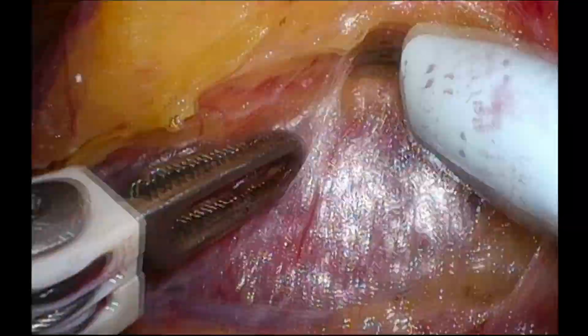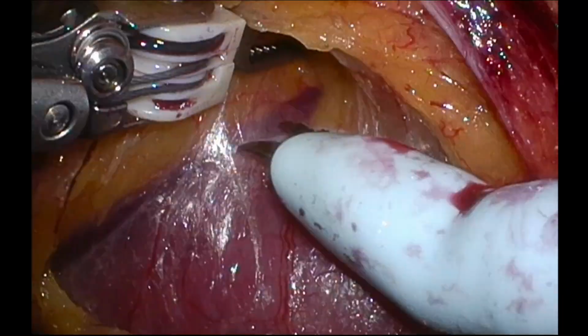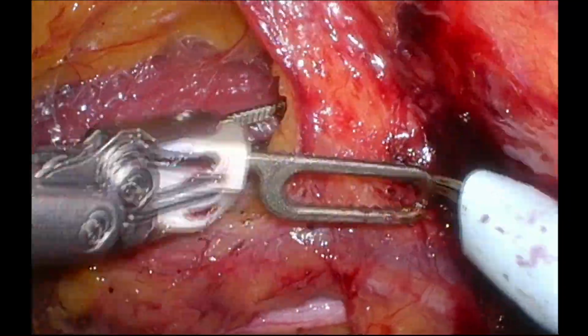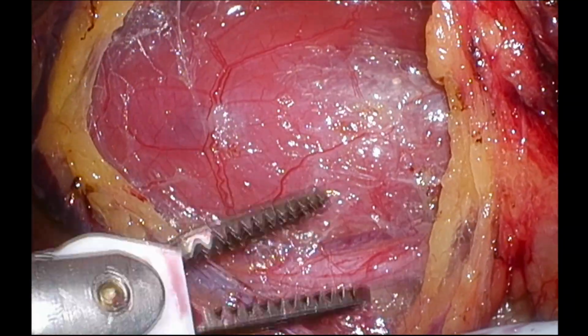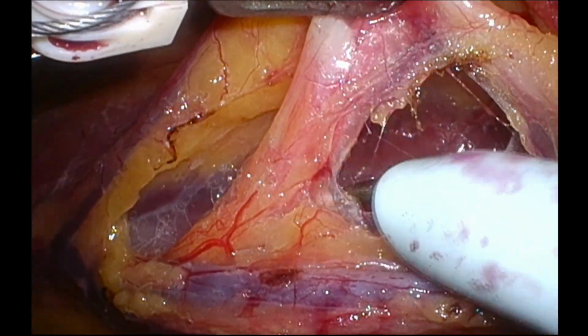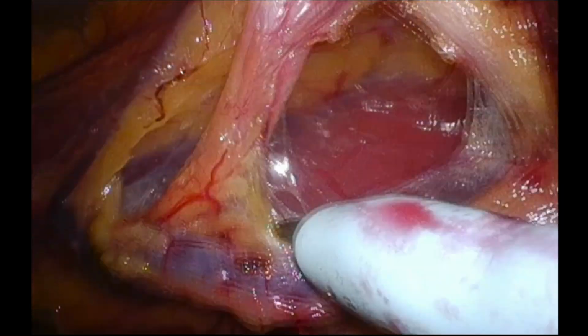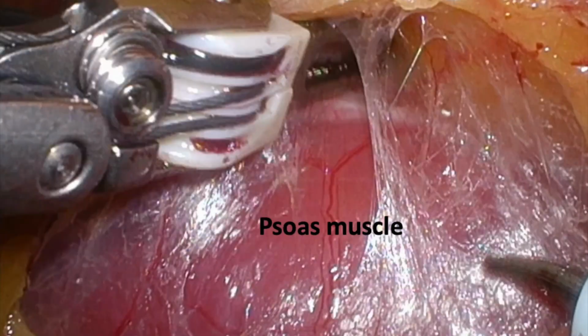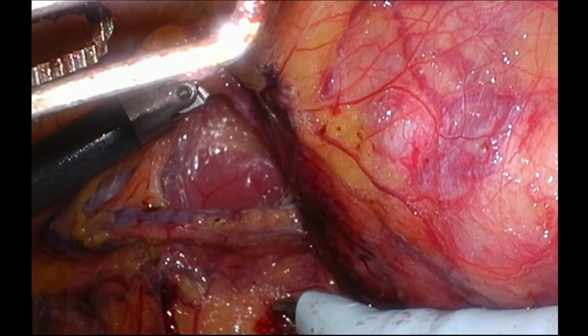Unlike left side where gonadal vein drains into the renal vein, in the right side gonadal vein drains directly into the inferior vena cava. Thus on the right side gonadal vessels are not sacrificed. Instead, ureter is dissected free from the gonadal vessels. Ureter is lifted off from the psoas muscle using retraction arm, that is the prograsp.